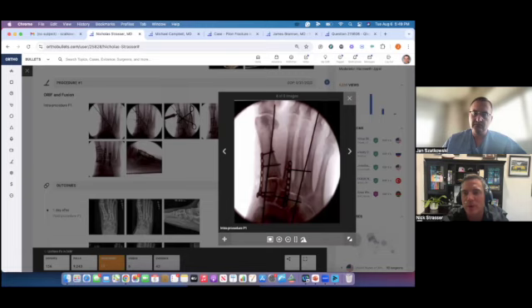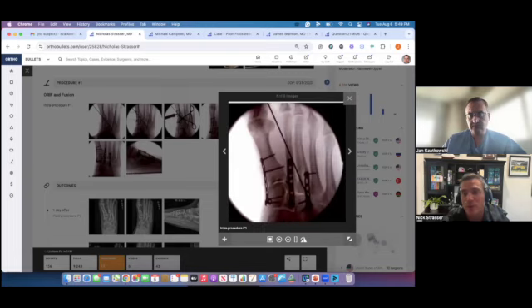I've had a couple of these where I haven't paid close enough attention to the first TMT joint reduction, especially if you're doing a fusion, because then you lose your cartilage. So you have to think, the first is supposed to be angulated a little bit medial, a little bit away from the second, and you have to make sure you recreate that. So sometimes I'll even look at the cartilage on the medial cuneiform before I remove it and make sure I see where it goes.